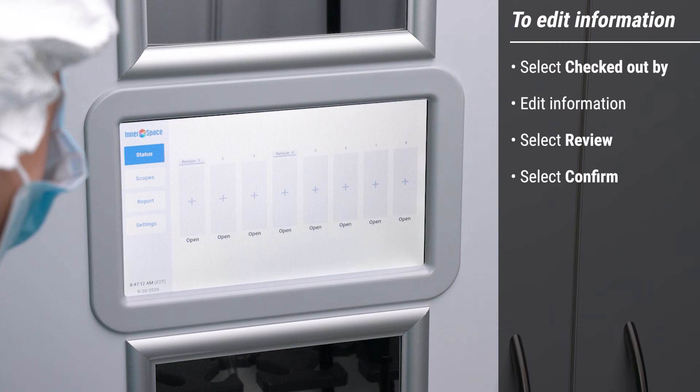You can now remove the scope from the cabinet. After removing the scope, the Remove prompt will display for 2 minutes.